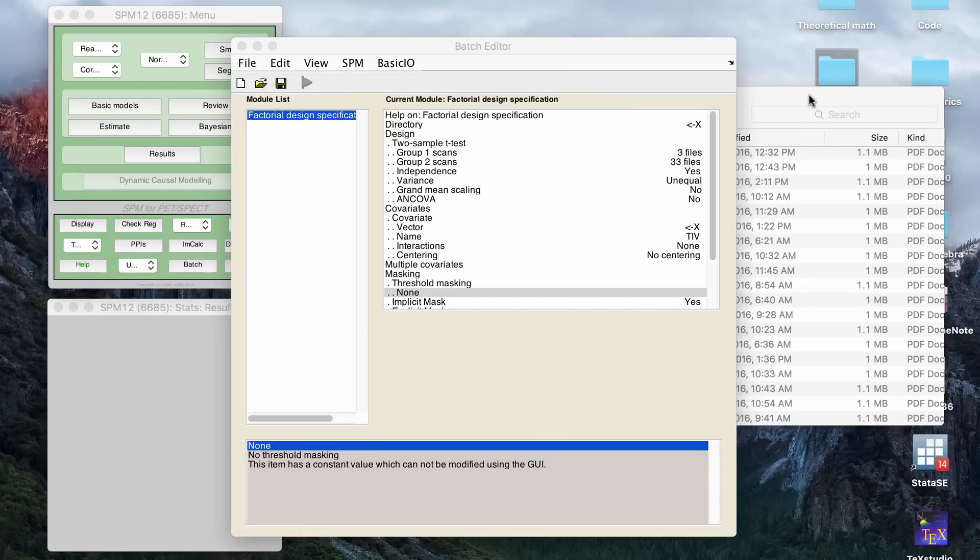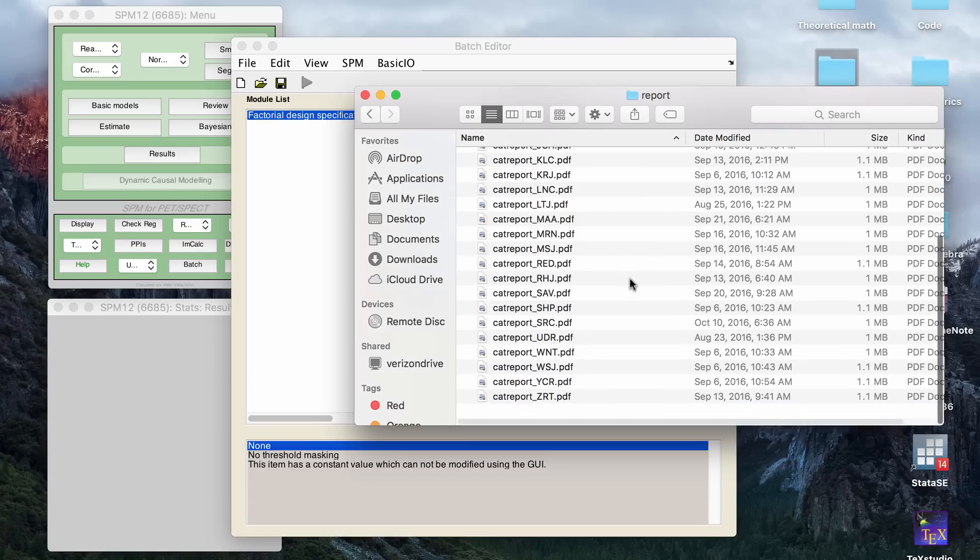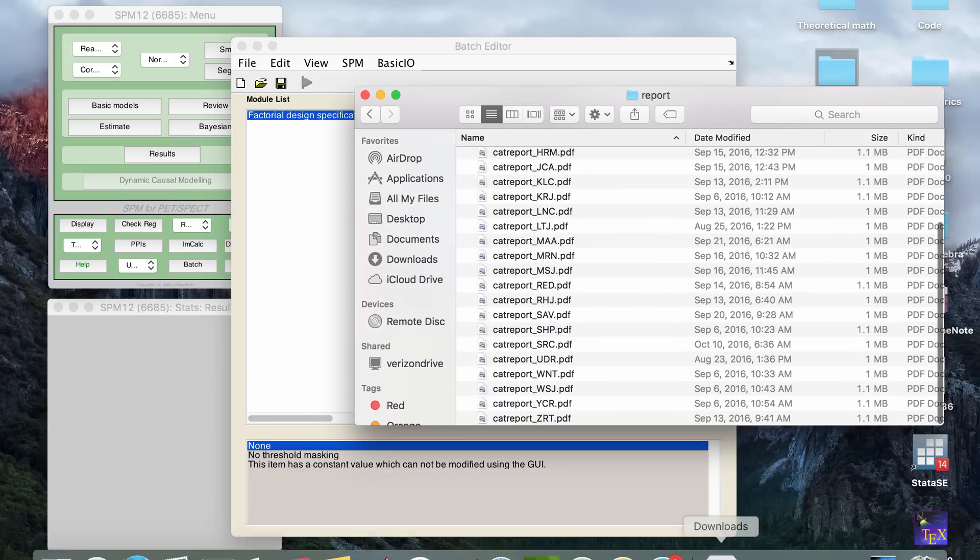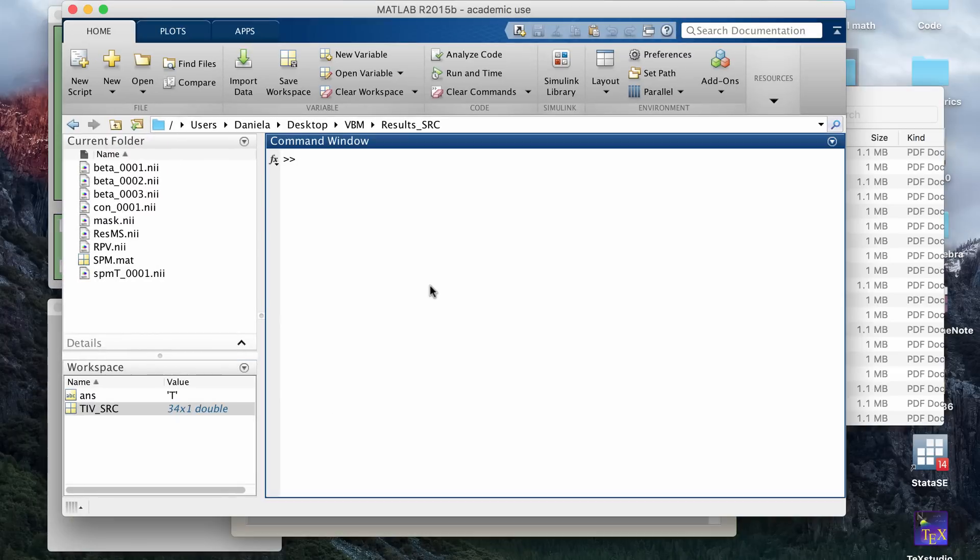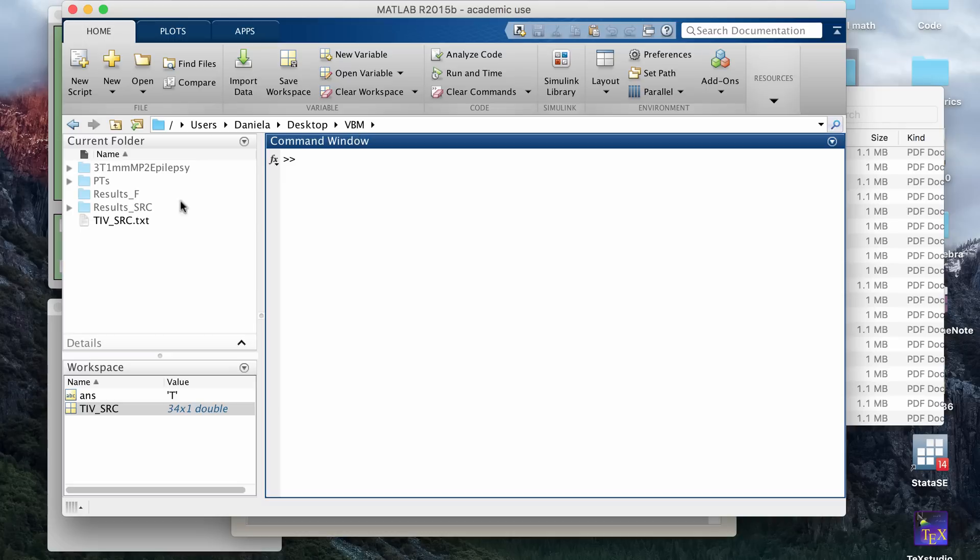So after you create that text file manually, then let me show you how you load it into your GUI. So you want to go to your MATLAB terminal and then go to the folder where you have your text file. So for me, it's here and I can see it in my current folder window. Then you want to go to the terminal and type load, TIV, and the name of your text file.